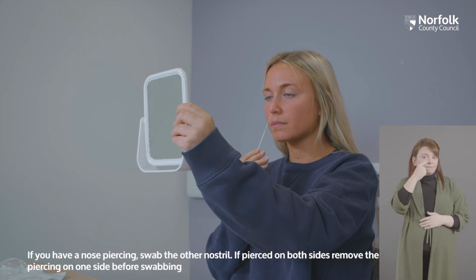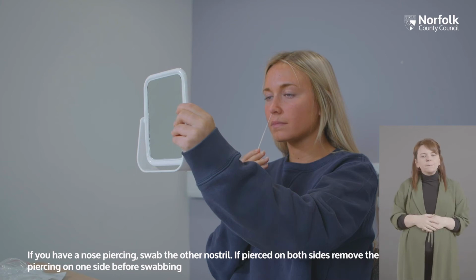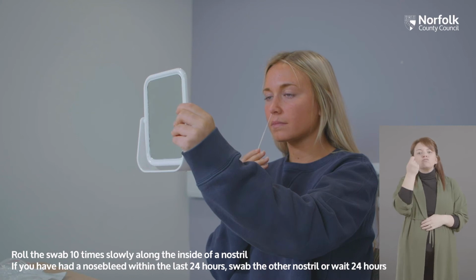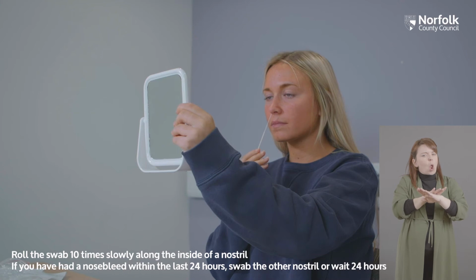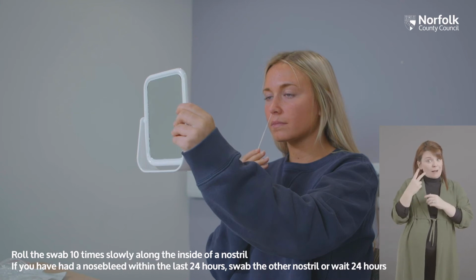If you have a nose piercing, swab the other nostril. If pierced on both sides, remove the piercing on one side before swabbing. Roll the swab 10 times slowly along the inside of the nostril. If you have had a nosebleed within the last 24 hours, swab the other nostril or wait 24 hours.